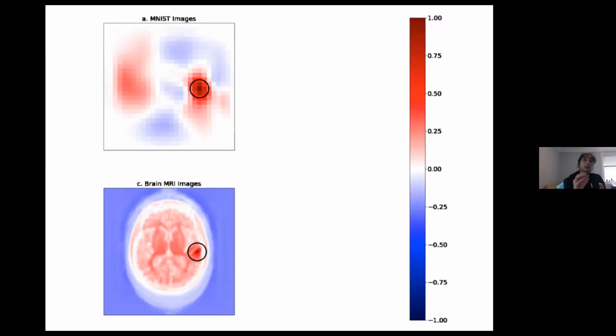And so you can get a lot of information about what value you expect to exist at a particular pixel just by looking at the values of the neighboring pixels. And that's the characteristic that allows current image space approaches in convolutional neural networks to do really well. Because convolutional neural networks apply these local convolutions, which only take in data about a small neighborhood and output some value corresponding to that local neighborhood. And these images that I'm showing on the slide suggest that those local correlations are enough to do a really good job of inferring what should exist at a particular pixel.